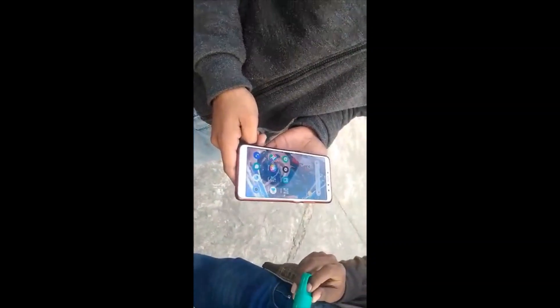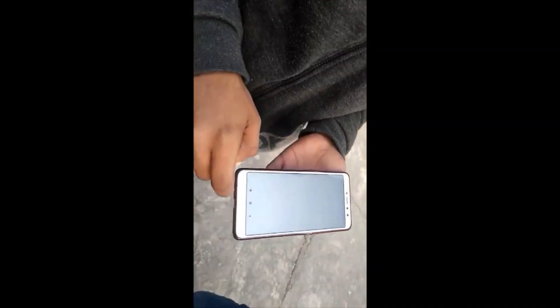Now let's see the live demonstration. When the SOS button is pressed, the message will be sent within 14 seconds to the caretaker. As you can see, the message has come from the server. You can open it and find the link for the location where the person is standing. Now you can see the location of the person where they are standing.